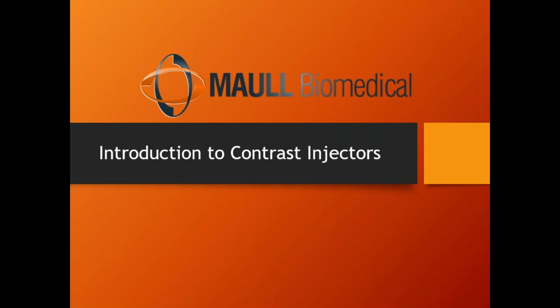Now, some of the X-rays that go into the patient are going to get absorbed by the patient, and some are going to pass through the patient, penetrate the patient. We need both things to happen, because the X-rays that strike that plate make that plate turn dark. We'll assume that plate starts off as a clear blank image, or a white image. As X-rays strike that plate, it starts to turn dark, and the more X-rays that hit it, the darker those areas become.